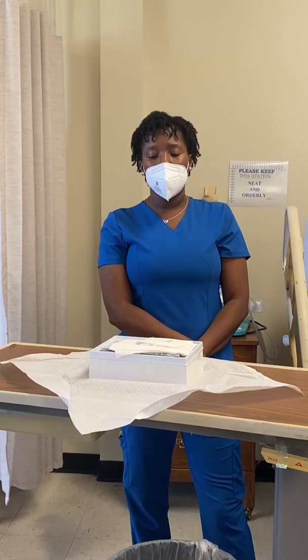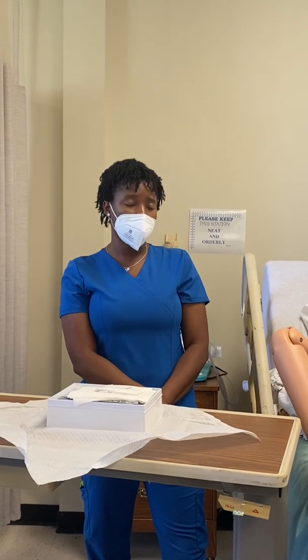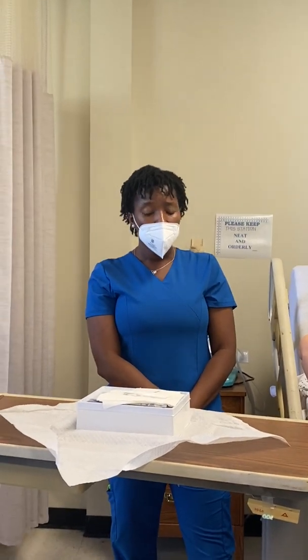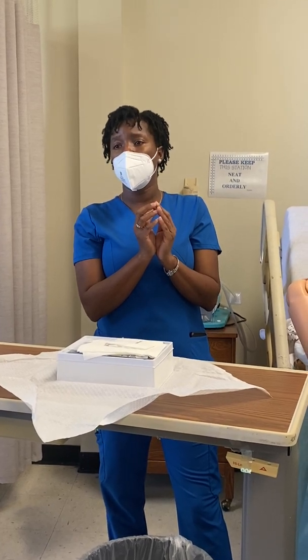Some people choose to put on their gloves after they do these next two things. That's completely up to you. I like to go on and put my gloves on because then I know everything I'm working with is sterile. It does not matter to me how you do it. Some people even choose to put on their sterile gloves and fix everything here and then just go from here. I don't like that because there's too much distance between me and my patient. But I can't tell you how to do it. That's completely up to you. You do what makes you feel more comfortable.